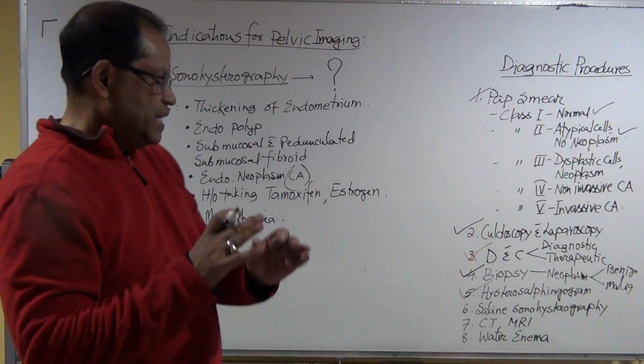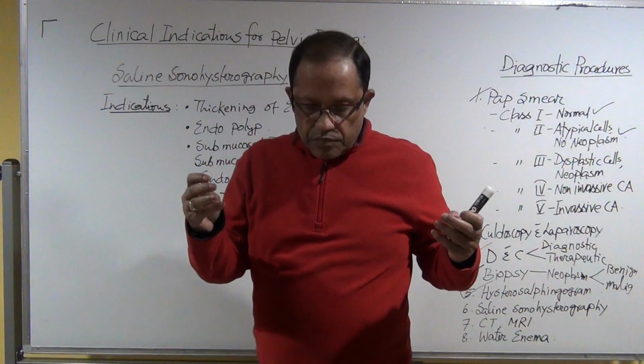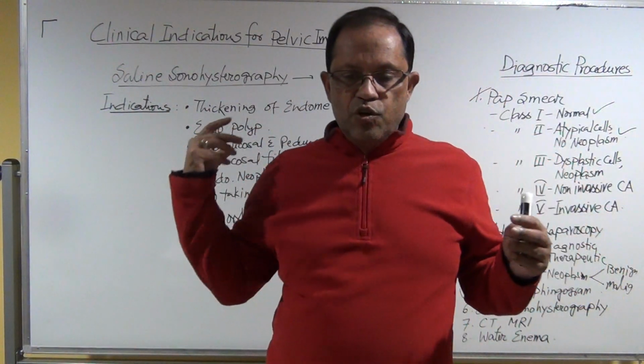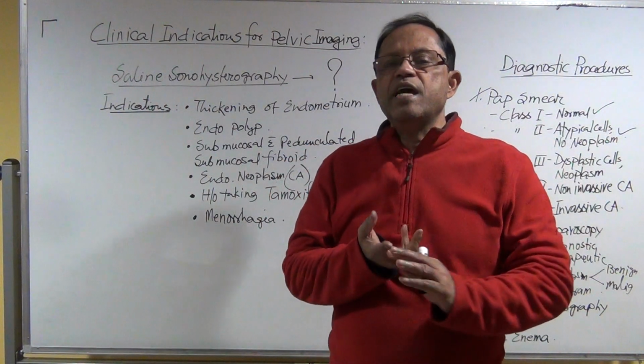Now let me give you the story. In saline sonohysterogram, there is an ultrasound guidance. So sonographers will be there.